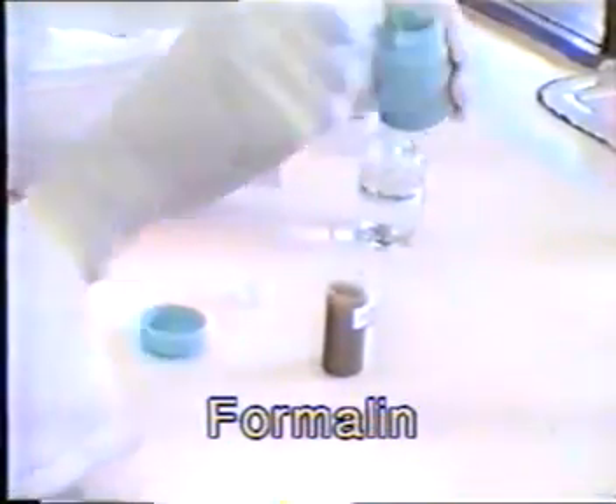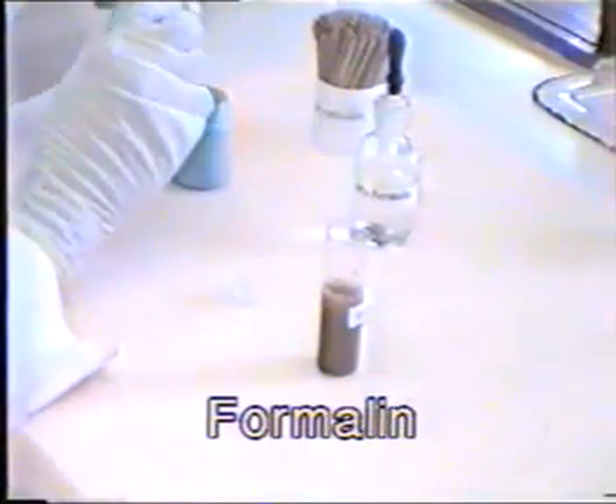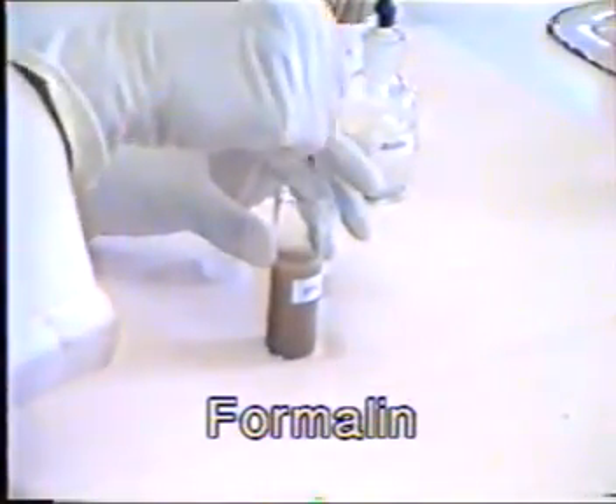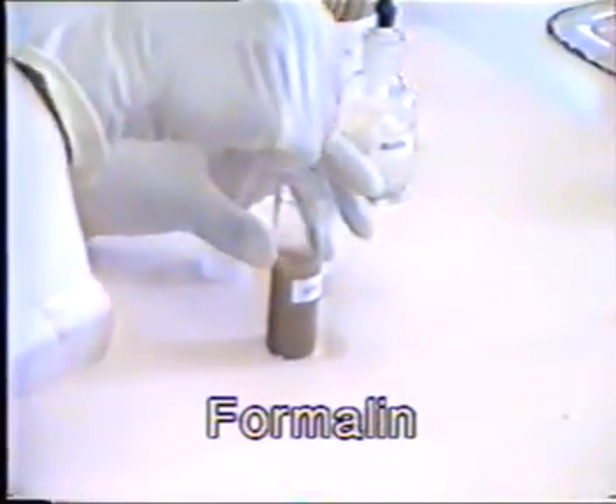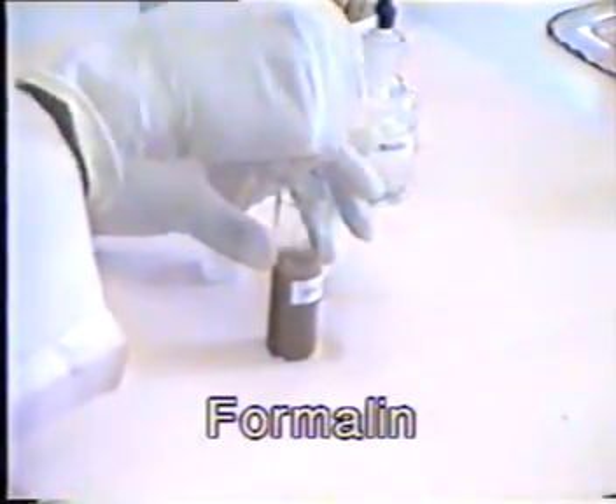Mix one part of faeces with three parts of preservative. Stir thoroughly. Screw the lid tightly to prevent leakage. Label properly.